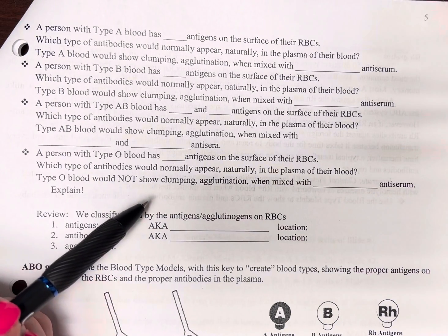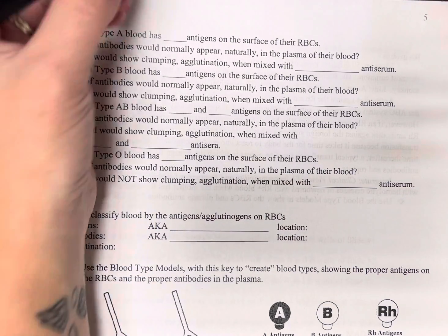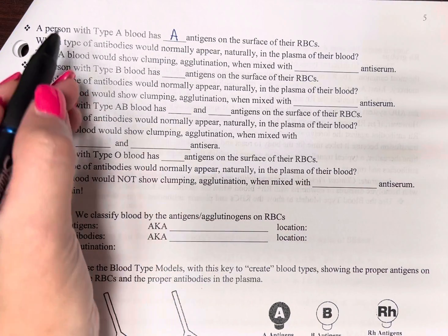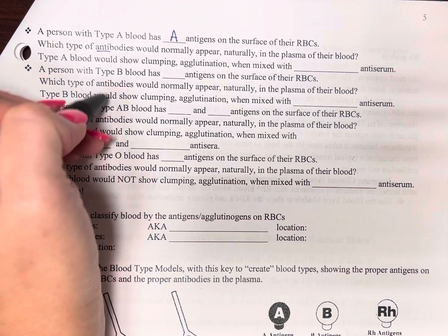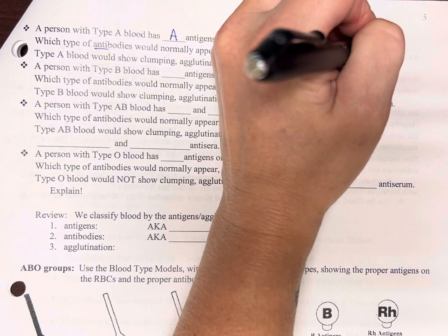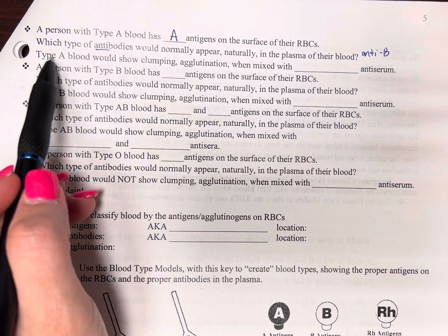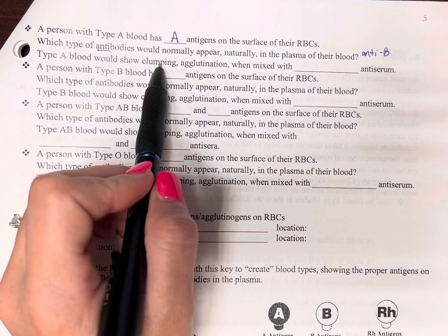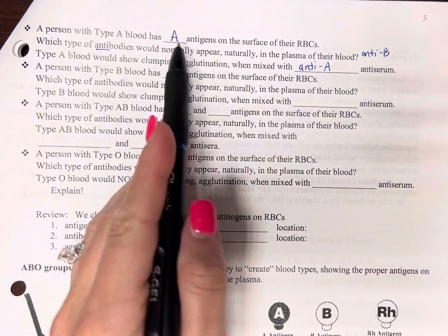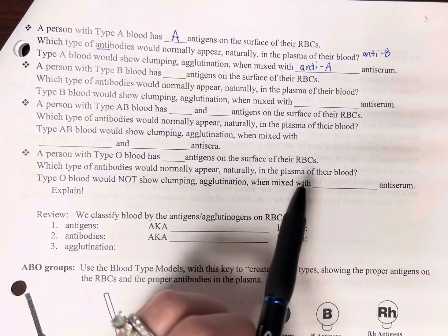Continuing with the blood typing, let's look at it this way. Somebody that has type A blood has A antigens on the surface. So naturally, the type of antibodies they're going to have, they don't want to react with themselves, so they're going to have anti-B. Now, type A is going to react or show clumping when you mix it with anti-A. A and anti-A, so antigen, antibody, cause clumping.